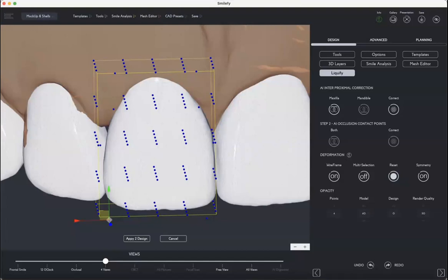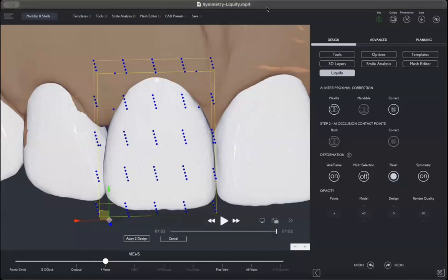very easily, because that's the problem. If the tool is so complicated, it changes the form of the tooth, but nobody can work. I think Planmeca, or I don't even remember, somebody had a tool to create molars, and there were some really super talented artists, and they created design molars with every single detail, like a sculpture. But these guys are 2 in the world who can do all this beautiful stuff.